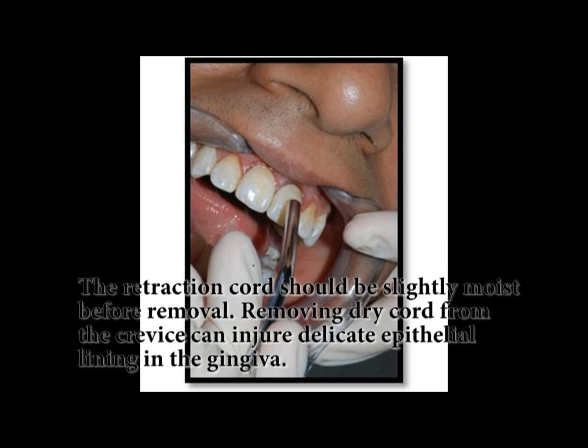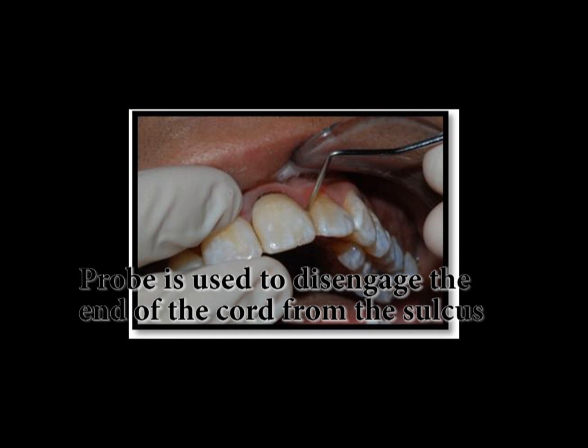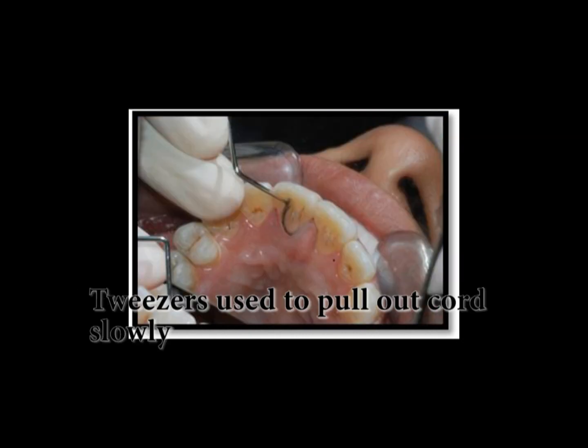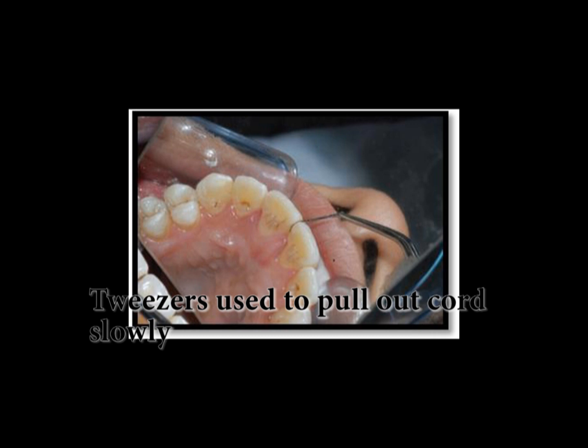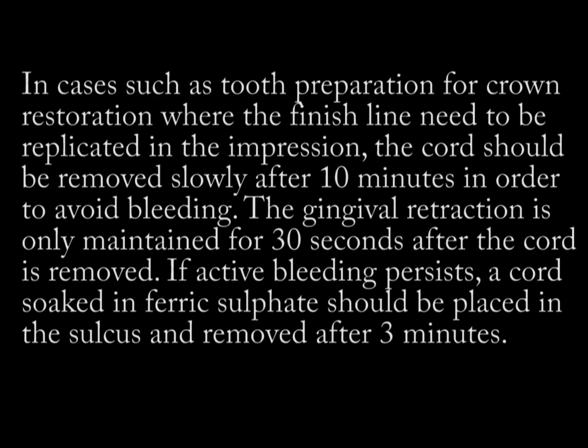The retraction cord should be slightly moist before removal. Removing dry cord from the crevice can injure the delicate epithelial lining of the gingiva. A probe is used to disengage the end of the cord from the sulcus, and tweezers are used to pull out the cord slowly. In cases such as tooth preparation for crown restoration where the finish line needs to be replicated in the impression, the cord should be removed slowly after 10 minutes to avoid bleeding. Gingival retraction is only maintained for 30 seconds after the cord is removed. If active bleeding persists, a cord soaked in ferric sulfate should be placed in the sulcus and removed after 3 minutes.